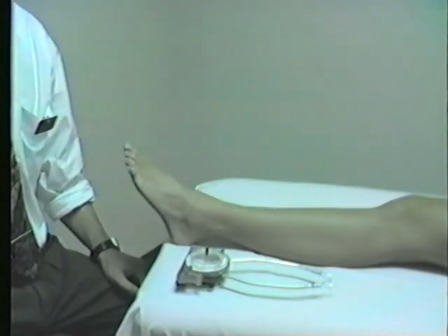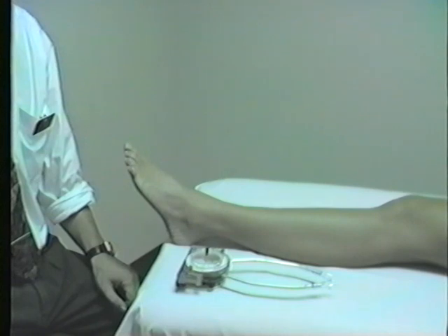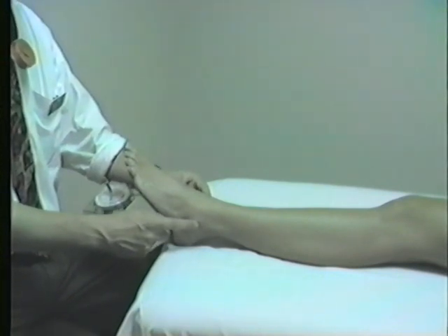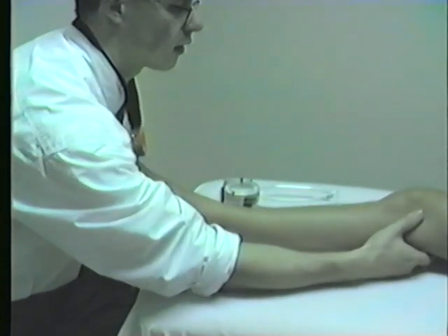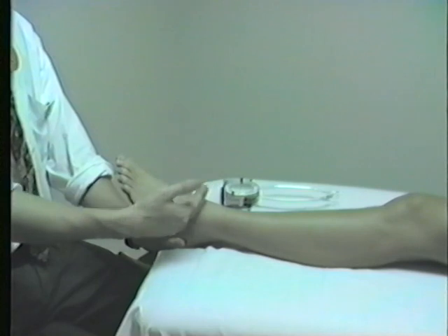Next, we're going to demonstrate how to measure malleolar torsion. This is of importance with all patellofemoral problems, mechanical dysfunctions of the subtalar joint or the ankle joint — everything that concerns the lower extremity. Podiatrists and physical therapists measure this a lot, and here's how we do it. I attach the tool again, and I contact both the medial and lateral malleolus — I palpate it. I can read the inclination of the line between the medial and the lateral malleolus. Before conducting this measurement, I will also always make sure that the knee flexion axis is horizontal, because then I know how much this axis is turned relative to the knee flexion axis.